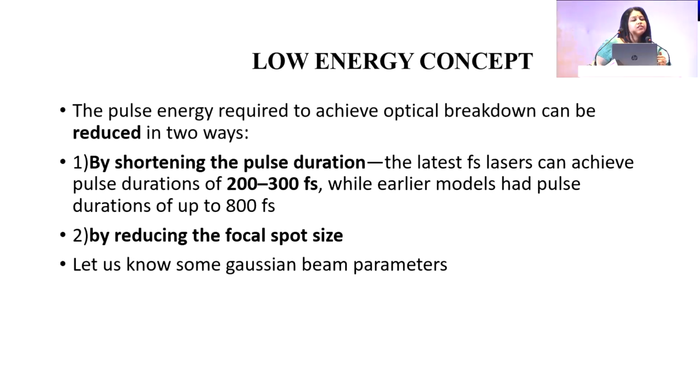Why is low energy concept needed here? And before that, how come ZIEMER adapted to this low energy concept? By two ways.